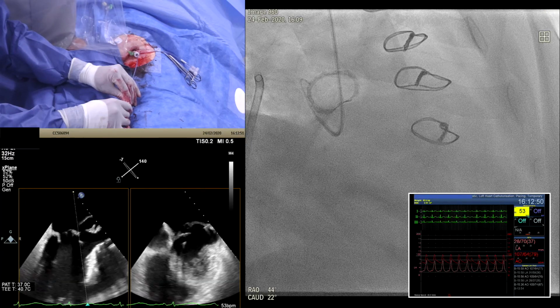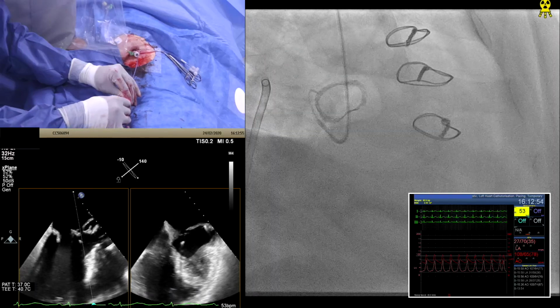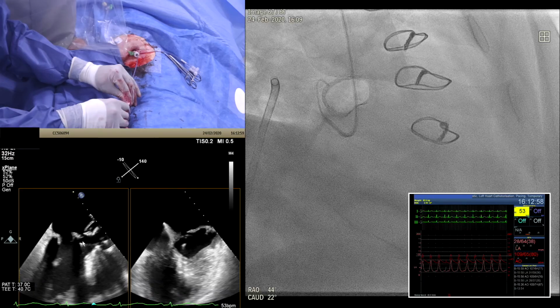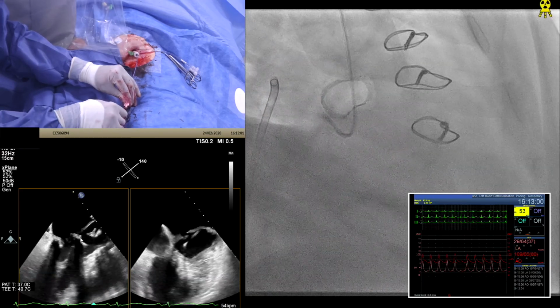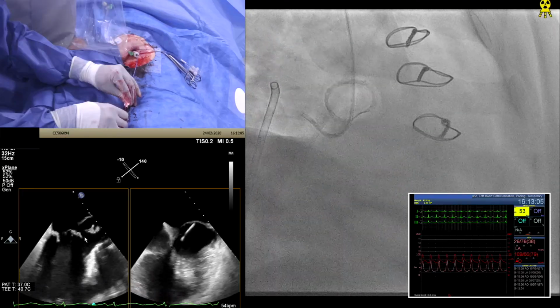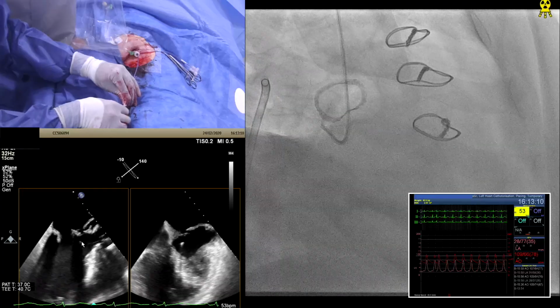Yeah, so where is that wire? That's still not gone through to what I want. No, it's still just going under the mitral valve at the moment. You need to come back just a little bit more, because as you go forwards, the tip is somewhere here. That's it. Now you're nearer. Can you see it's moving now? Okay, so here we are. We're going to have to shoot it. So I'm doing it mainly on echo because I've got to hit it.